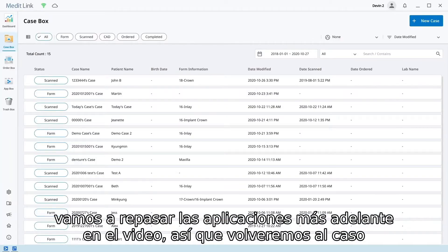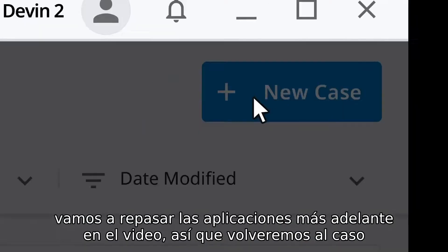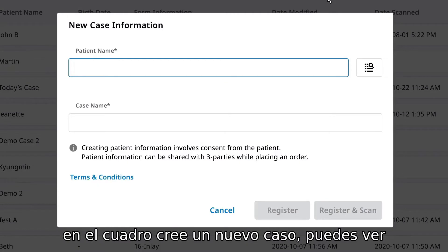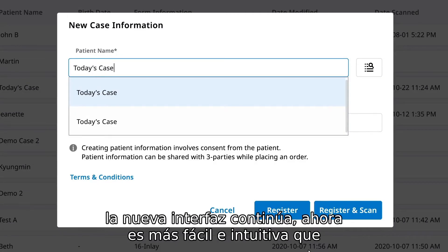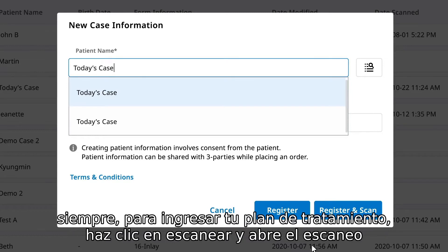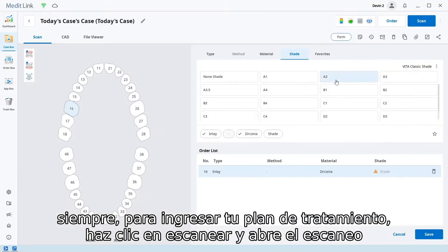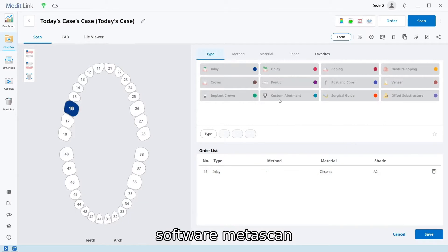We're going to go over the apps later in the video. So we'll return to the case box and create a new case. You can see the new interface continues — it is now easier and more intuitive than ever. To input your treatment plan, click scan and open up the scanning software MediScan.